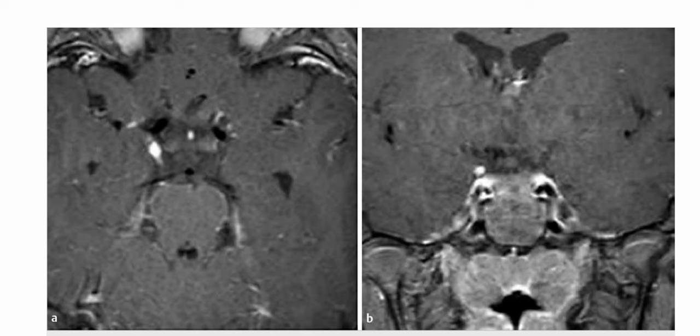So this is the case of a young girl who has presented with headaches and transient diplopia. These are the axial and coronal post contrast sequences. We can see that on the fat suppressed sequence there is focal enlargement and enhancement which is involving the cisternal segment of the right oculomotor nerve. So oculomotor nerve enhancement is seen in ophthalmoplegic migraine. Also, you can add schwannoma in the differentials along with meningitis, leptomeningeal carcinomatosis, neurosarcoidosis, and ophthalmoplegic migraine is the diagnosis here.